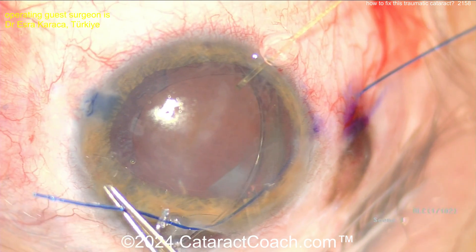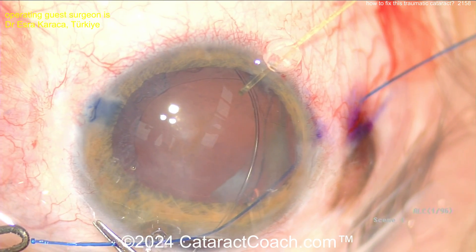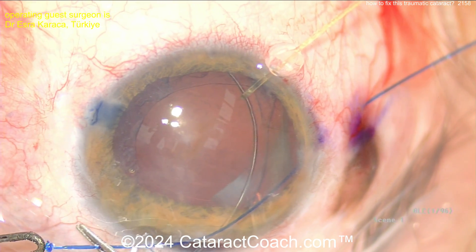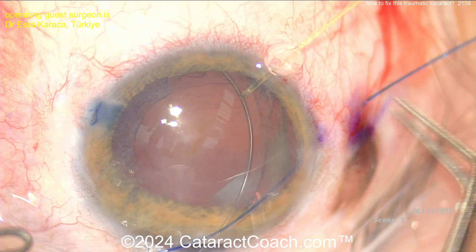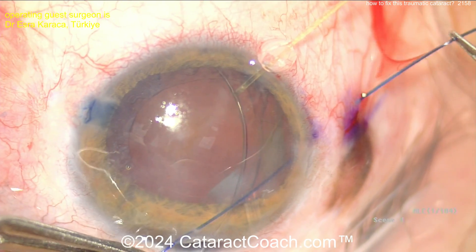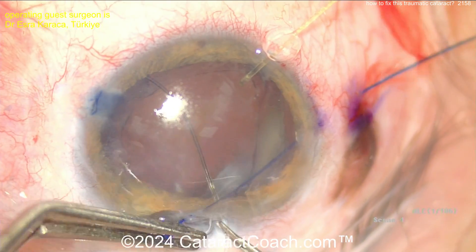Now use your cautery and make a flange there — make a nice juicy flange here. This can be big; this is not the flange that's going to be buried in the sclera. This is the flange that's going to hold the eyelet of the Cionni ring in place. As you know, the Cionni ring is a CTR with an extra little appendage on it that has an eyelet so you can fixate it.